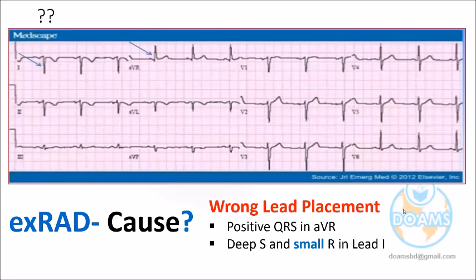Keep in mind, the patient does not have any chest pain, but you are thinking that there is a Q. It seems to be a Q, though an R is a little visible here, so we might be confused. But look at aVR also. aVR should never be like that, an upright stroke, in a normal ECG. Usually it will always be down. For that, all 12 lead ECG is very important to see. So there is no change in the pattern here. The V1 chest leads are okay.